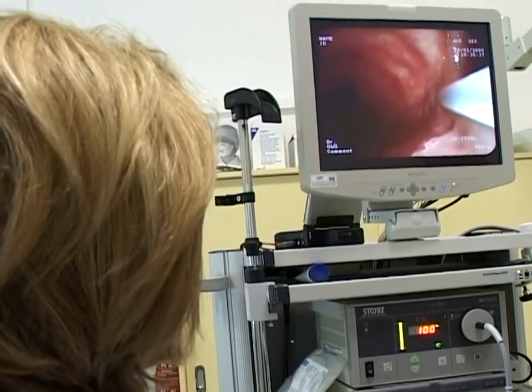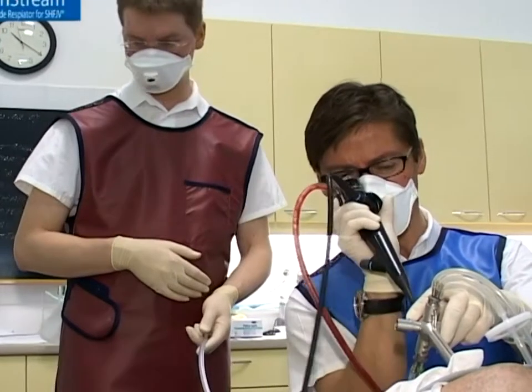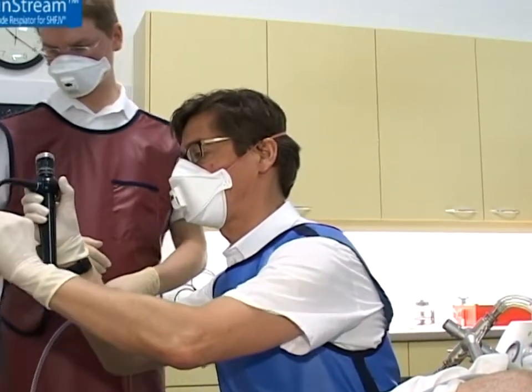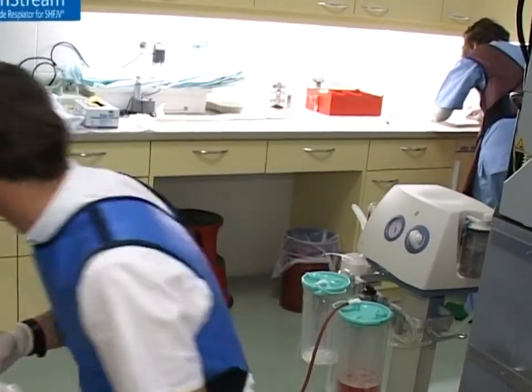From the anesthesiological point of view, subtle parameters can be controlled in this setting. In other words, jet ventilation is a helpful aid in the anesthesiological bronchological sector at our department. The new device, steered by electronic mechanisms, permits subtle and exact settings of ventilation parameters and consequently ensures a very high level of safety for the patient during the bronchoscopic investigation. Thus, the patient's ventilation can be monitored in an optimal way, and the clinician can react appropriately to critical situations during the interventions.